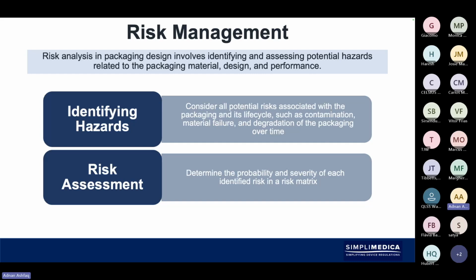But what happens, say, 15 months from now, if the label says it's got 2 years of shelf life, that's 24 months, and in between that time a breach happens and it fails because of that? It means that we didn't do the testing adequately over a period of time. It was done at a moment in time, but not proven over time.